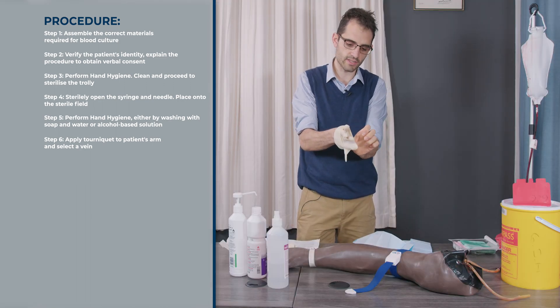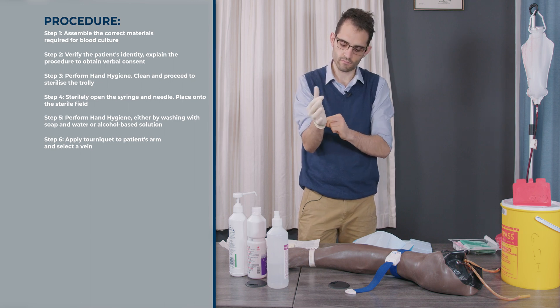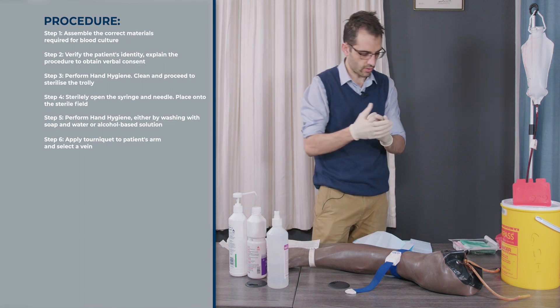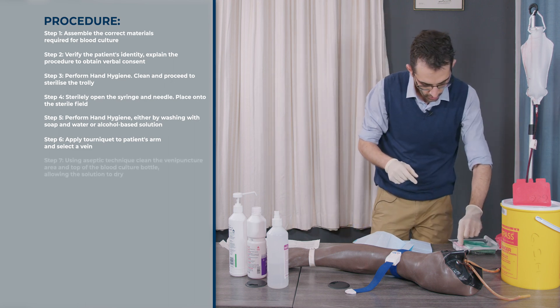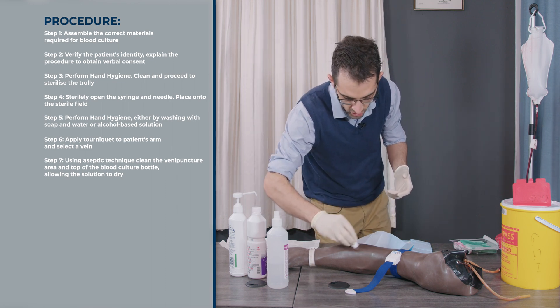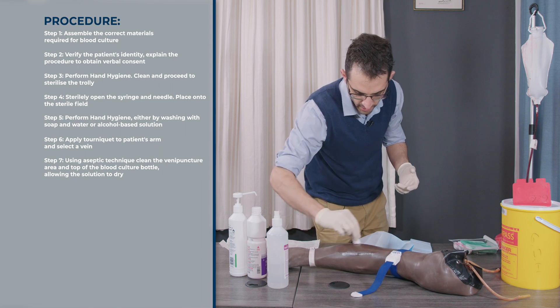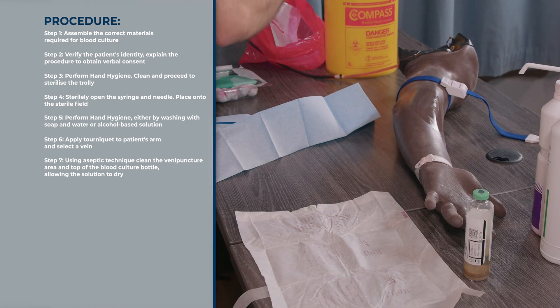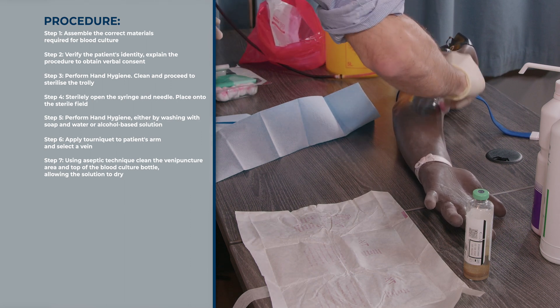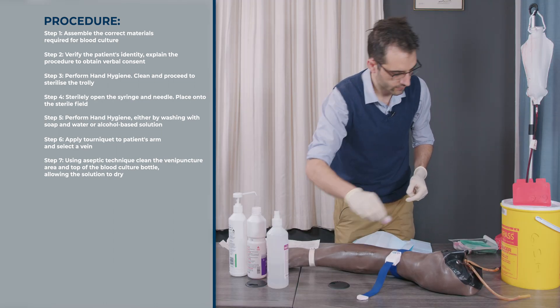Put the gloves on in a sterile manner. You're then going to clean the area — importantly, pass the cotton from your left hand to your right hand regardless of whether you're left- or right-handed, and clean in a circular motion over a large area to make sure everything is clean. Discard. Clean again in a circular motion, passing left hand to right hand. Discard.